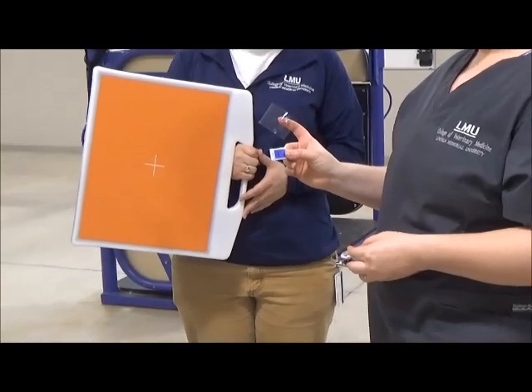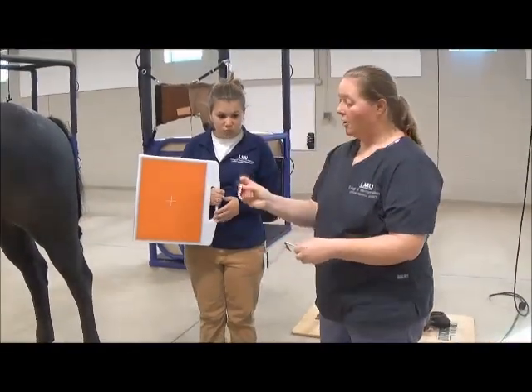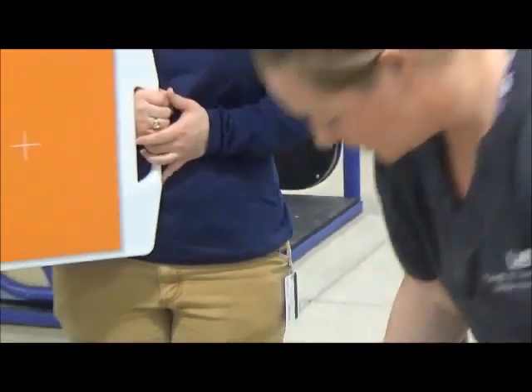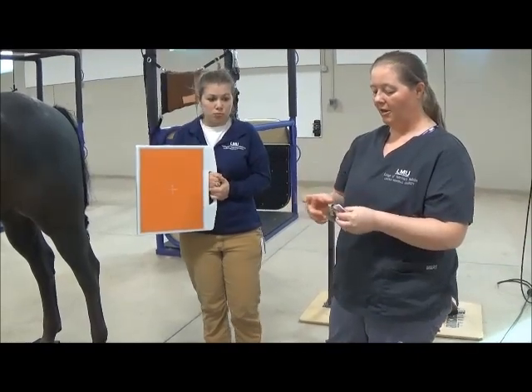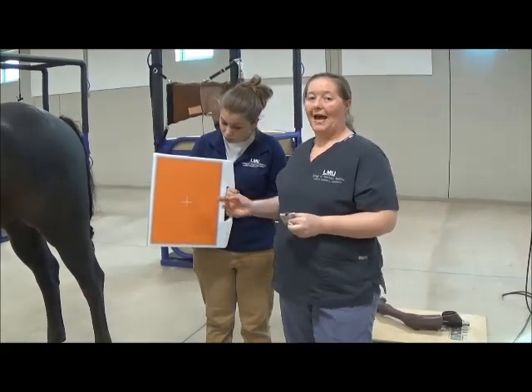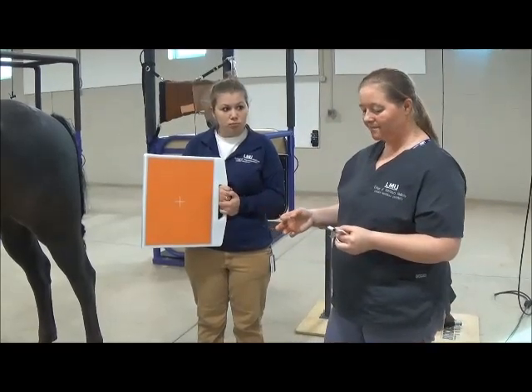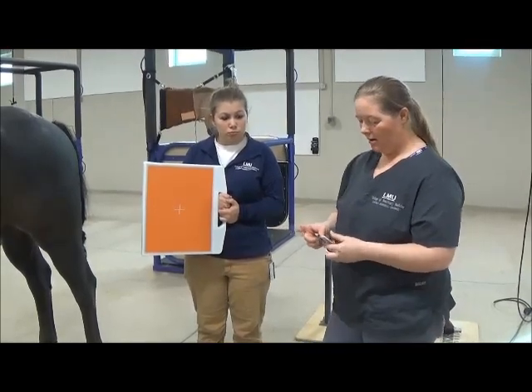The other thing with the marker is that sometimes you don't have an oblique marker. So here we have markers that are oblique markers. Sometimes you don't have those, and that's okay, because there's a rule for placing markers on the plate, and this applies to horses and small animals and cows, every animal. The marker is always going to be dorsal or lateral on the plate, depending on the positioning. So we're going to go through the views of the hock again with the markers placed correctly so that you can see how that's done.